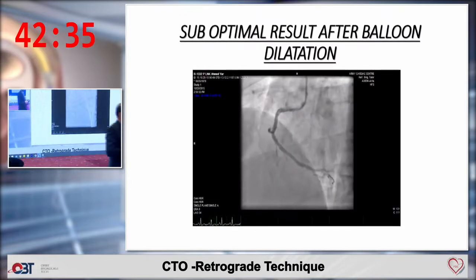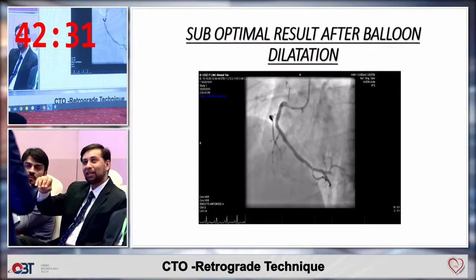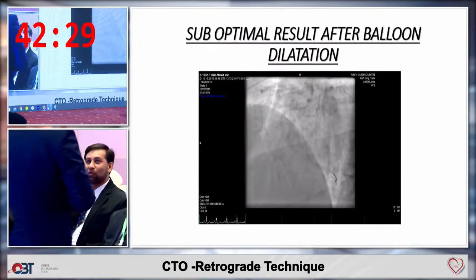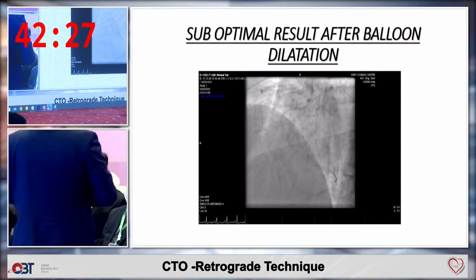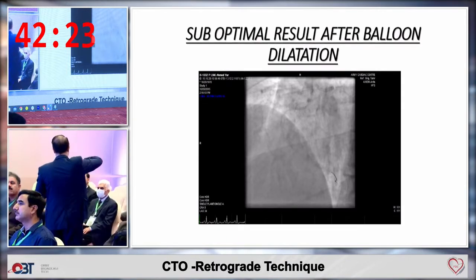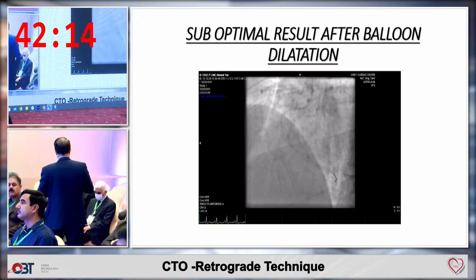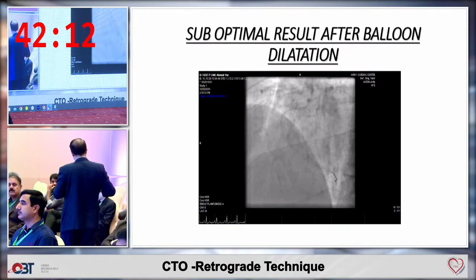Once you externalize the RG3, do you reverse it in order to incorporate other balloons or wires, or do you keep it the same way? We keep it the same way. We keep it because it gives a lot of support. Right, but many times when the tip is out, it's so mangled that you can't actually introduce balloons or wires. You are right. But in that case, if you have made a path, you can take an antegrade wire and place it down, and then take out the RG3 and use the antegrade wire.